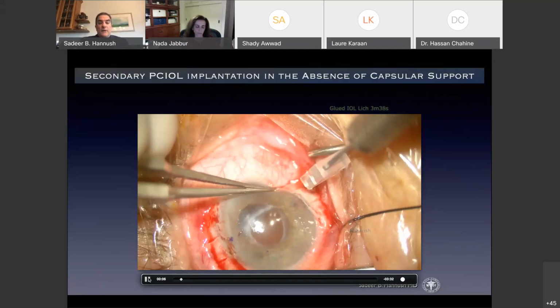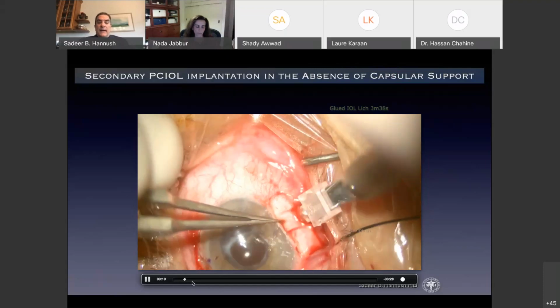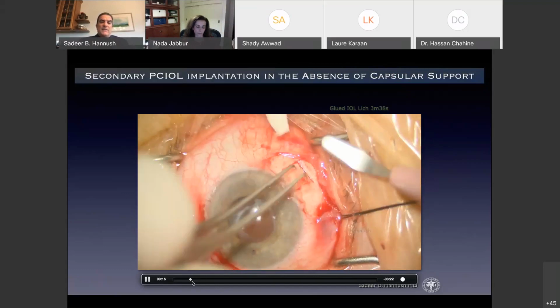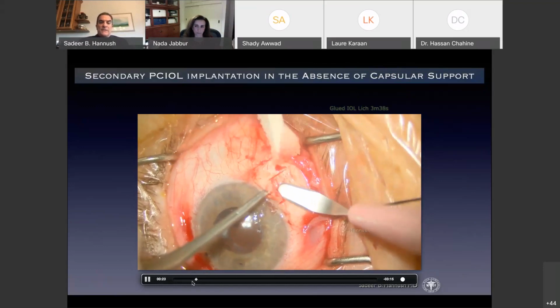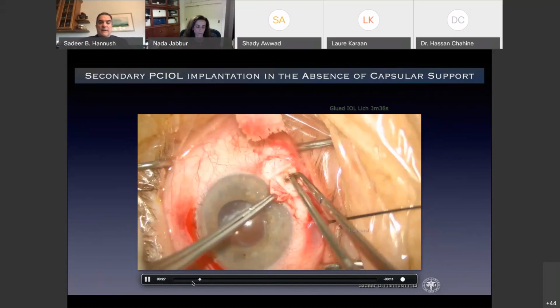I see. So here we go. This is the classical technique that Amar Agarwal described in, I would say, 2006 or so. It was not adopted until the early 2010s. I'm creating scleral flaps here as you would for a trabeculectomy.